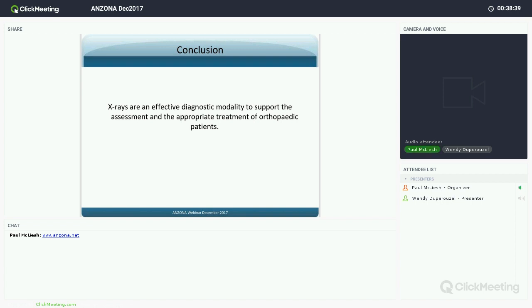And like you said, the best way to learn it is just to look at lots and lots and lots of x-rays. When you're starting off, look at x-rays when you know the diagnosis. Look at x-rays with someone who can tell you where the fracture is, what the injury is, so you make that connection between the diagnosis and what it looks like. And then once you start feeling more comfortable with that, start looking at x-rays without knowing the diagnosis, try and make a decision in your head, and then go and check the diagnosis. That's a really good way to go about learning. And over time, that gets better and better.